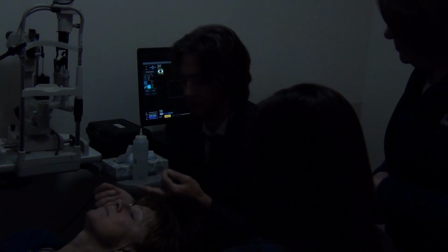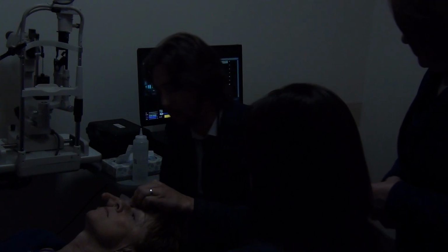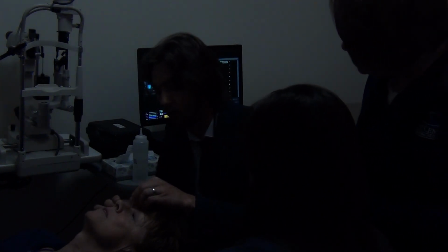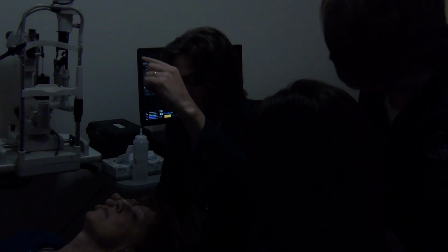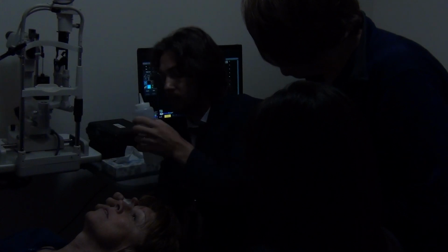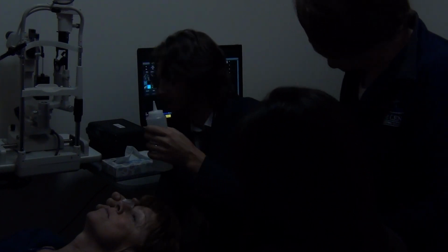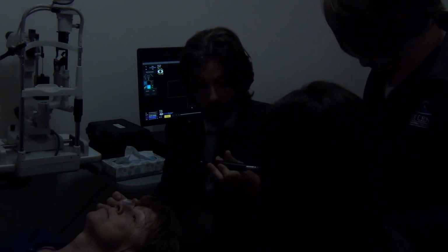I usually put tissues like this, so if there is any leakage, I will catch the water. Open your eyelids wide. Around the cornea, just look straight right here. Perfect, like this. Both eyes are open, and the water is coming. So it doesn't hurt at all. Put quite a bit in there. The more you have, the better, because water may leak, and then you would need to come back to the bottle and refill it.